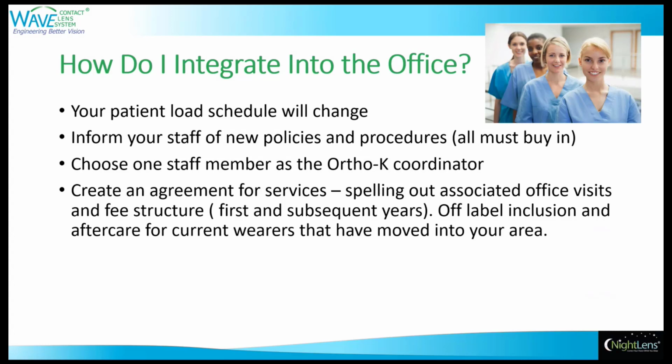You should also include an off-label paragraph in your service agreement because once you become more experienced with fitting Ortho K, there will be a time when you would want to fit off-label.